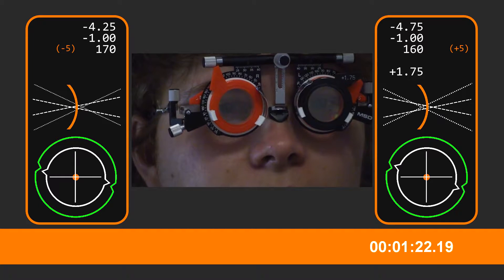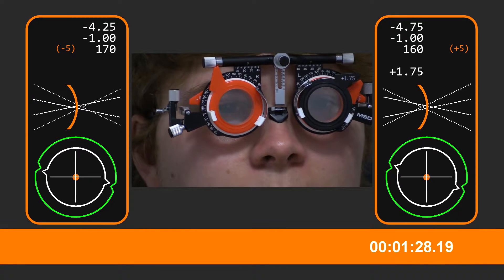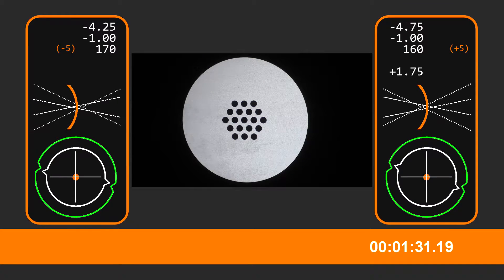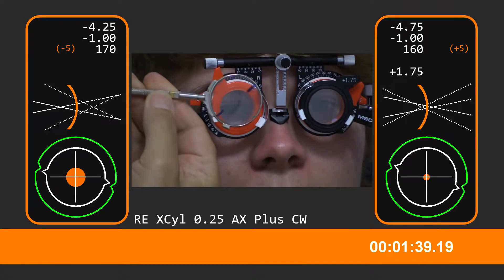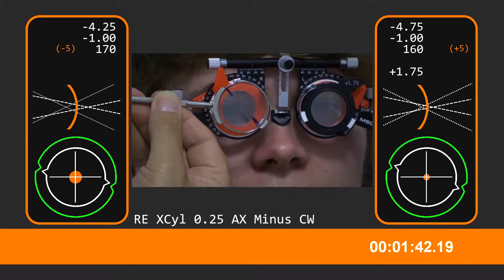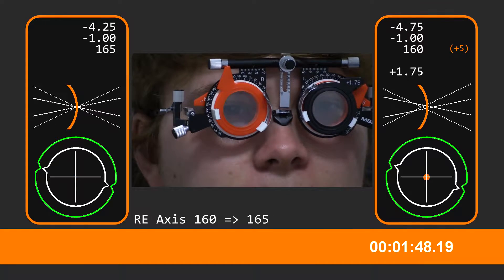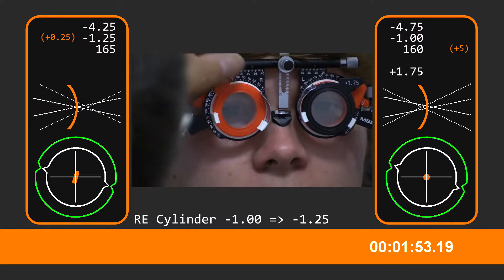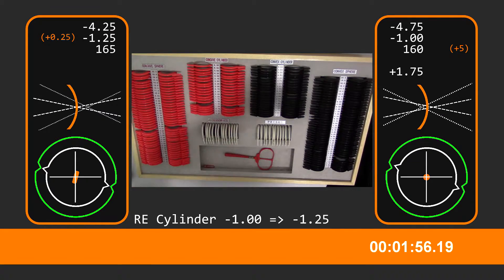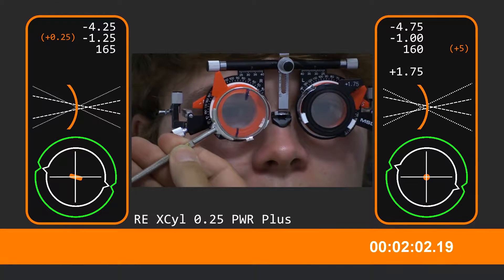Let's have a look — just put the lights up a bit more. Now see those spots there. Keep looking at those spots. Choose which side of these — this lens is clearer — the first side or the second side. First. Second. And these two, first or second? Last. First one. First one or second? Second. And these two.